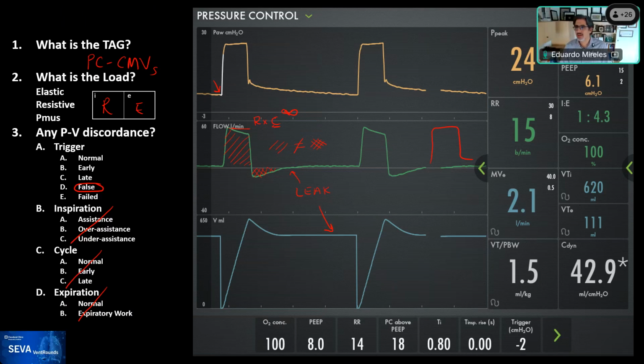Right, let's see on the chat, I see a couple. Yeah. So let's think a little bit about this. The challenge of using volume versus pressure. Rob, do you want to talk a little bit about this? Rob, are you there?